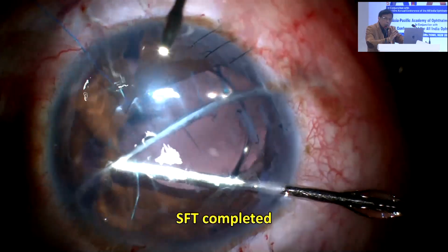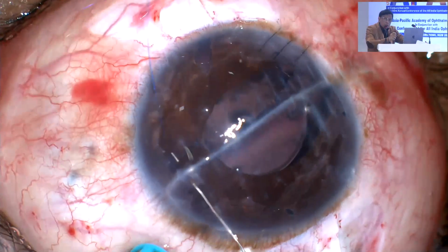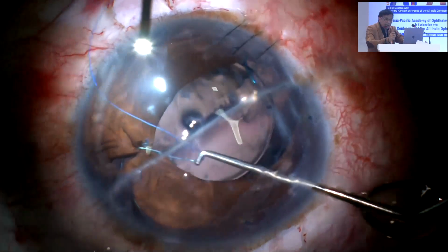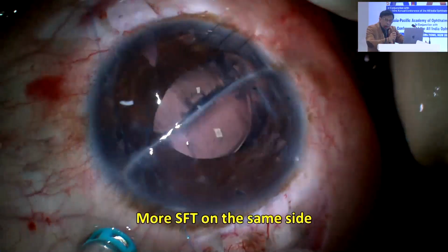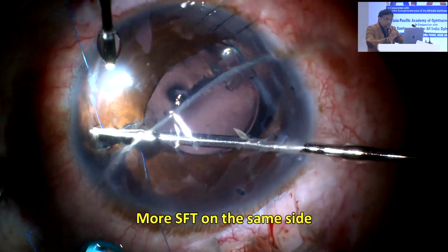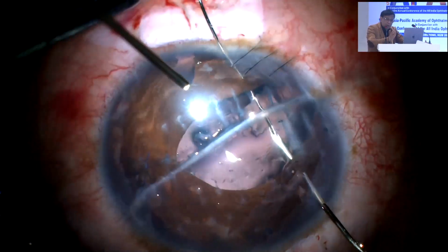A simple rule you can follow is, we have designed also a pinhole device. So keep it in front of the patient, made by Epsilon. What we do with the help of Jack Holladay, we made that. Keep it in front of the patient, ask him which pupil he likes. If he likes 1, we'll make the pupil 1. If he likes 1.5, we'll make it 1.5.